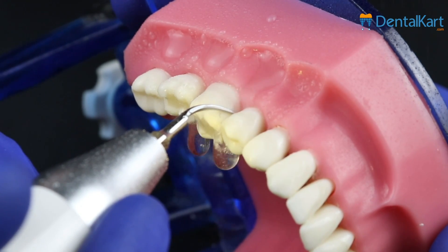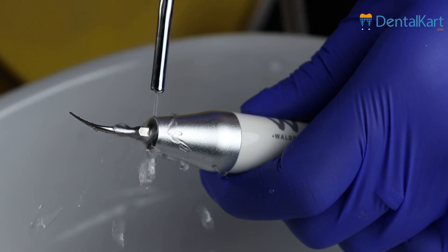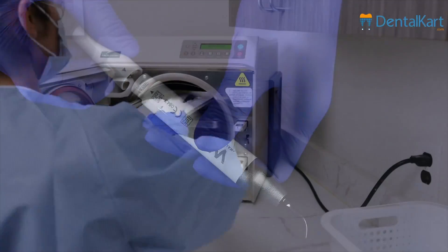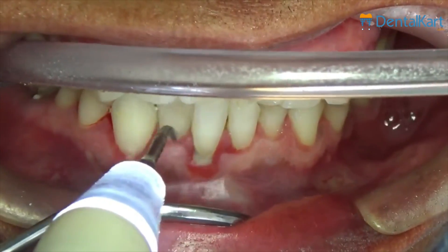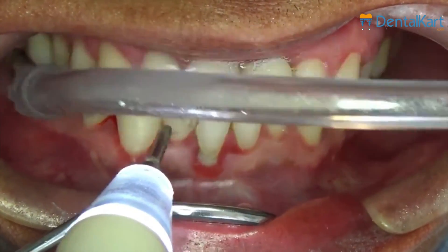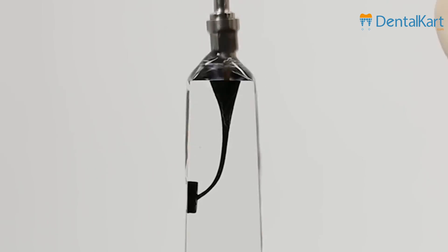After completing scaling, keep working for 30 seconds under the water supply to clean the handpiece and tip. Remove the tip and then pull out the handpiece for sterilization. It is intended for use in removing tartar and plaque from the surface of teeth as well as from periodontal pockets, and for cleaning and washing root canals.